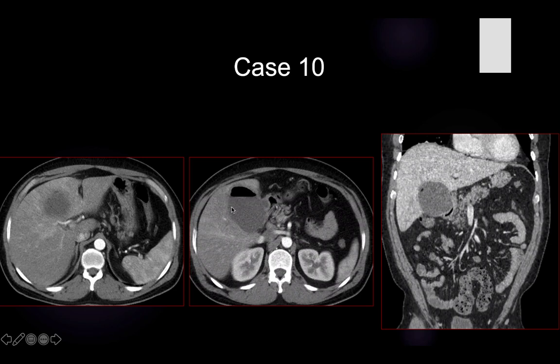Once you see a lesion in the liver showing an air fluid level, you should think about abscess formation. In this patient, it was a complication of a cholecystectomy. Here, there is an interesting finding usually associated with abscess formation: we can see that the area surrounding the abscess is usually showing enhancement at the arterial phase. This is called perfusion enhancement, and this is usually accompanied with an inflammatory process like an abscess. So this is an interesting sign seen associated with abscess formation. So this is a gallbladder fossa and segment 4-5 hepatic abscess.